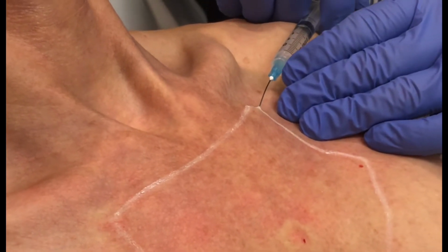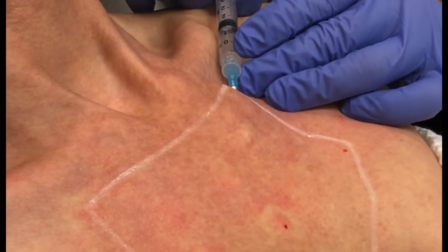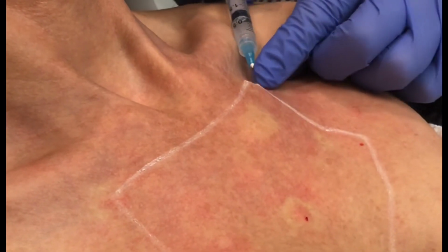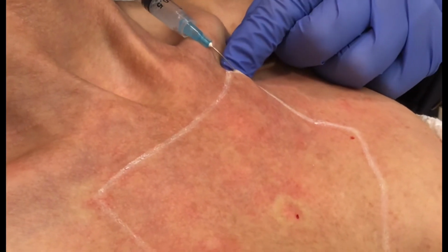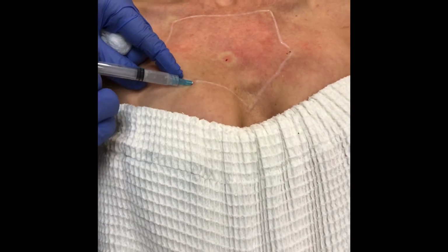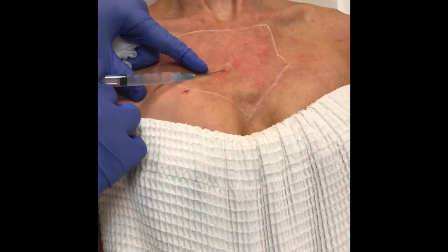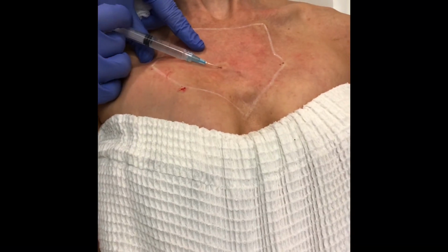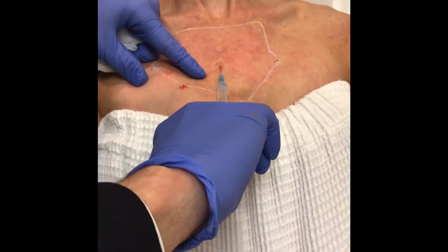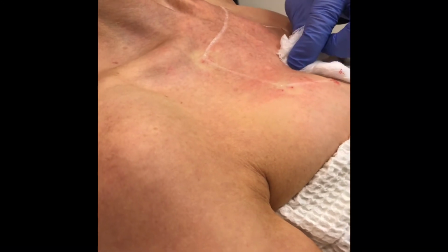We blend in actually lidocaine to add to comfort when we are delivering the Sculptra. Sculptra is actually mixed with sterile water, which makes it really easy to spread around very nicely. Okay, and that's all of the Sculptra.